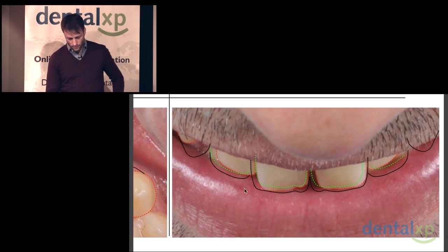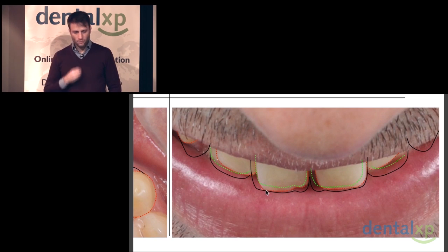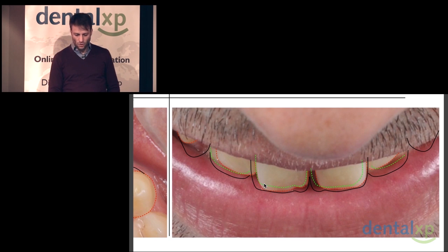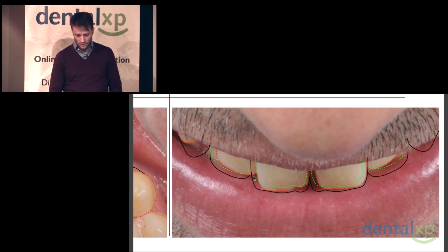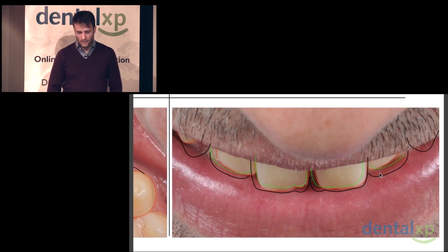Here, for example, we see that we don't need to add wax at all. On my wax-up, we're going to actually be touching the stone model on this area. I'm going to add wax on the distal, I'm going to add wax on the mesial. On this one, a little bit more even — we can see exactly on the lateral what I need to do with my wax-up.